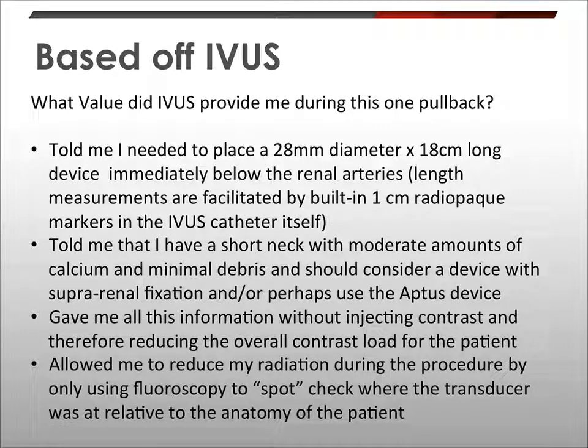It gave me all that information without injecting any contrast whatsoever to this point, reducing the overall contrast load for the patient. It also allowed me to reduce the amount of radiation during the patient by only using fluoroscopy to spot check where the transducer was relative to the anatomy of the patient. Thus, before ever placing the device, I have a complete picture of what needs to be done, and I've used no dye and minimal fluoro time, which reduces the overall procedure time significantly.